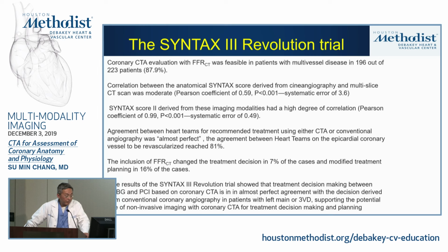So essentially, if you include CT-FFR, at this stage, agreement in terms of what to do and what vessel to bypass between the CT only versus invasive angiogram only is about 80%. Meaning in 80% of those cases, there's perfect agreement in terms of number of vessel bypass graft that need to be put in.